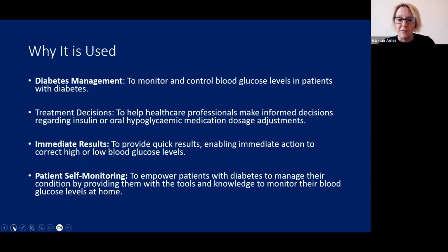Our blood glucose levels will determine different treatment decisions: when to treat, when to give medications, when to manage things such as hypoglycaemia. Blood glucose monitoring is a bedside test, so it gives us immediate results. If I was to send someone's blood sample off to the lab, those results would not be immediate. So it's a really quick bedside nursing procedure. And we do a lot of education with patients around self-monitoring of blood glucose. We need to be able to explain it correctly to the patient, giving them the knowledge and confidence to manage their blood glucose levels safely outside of the hospital environment.